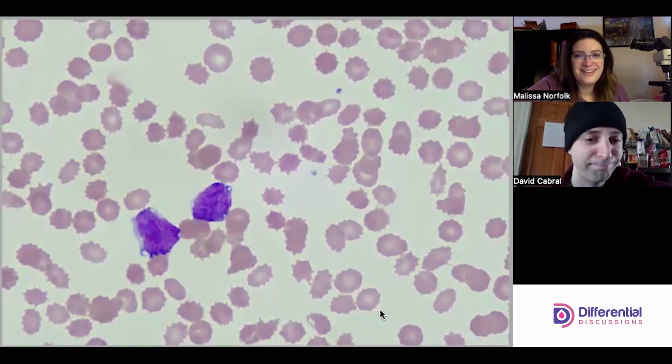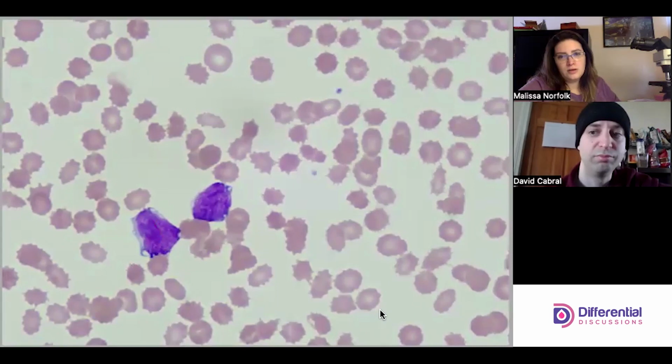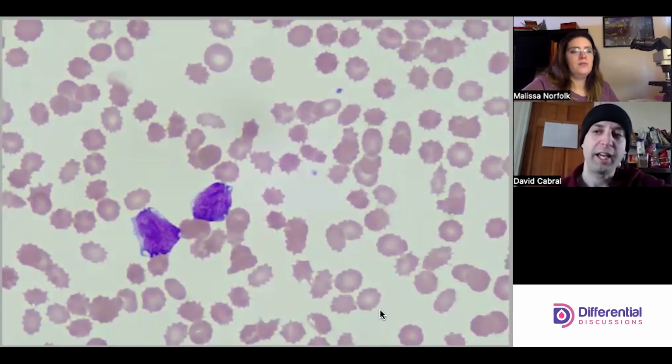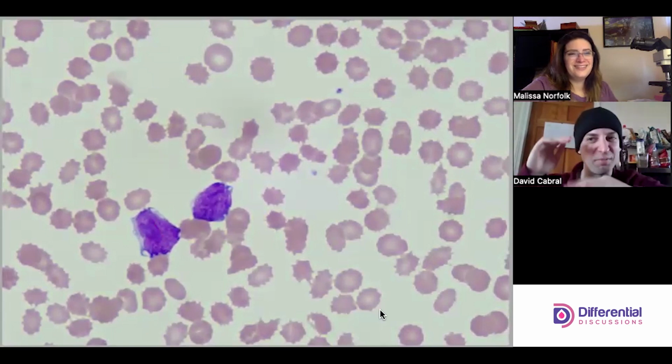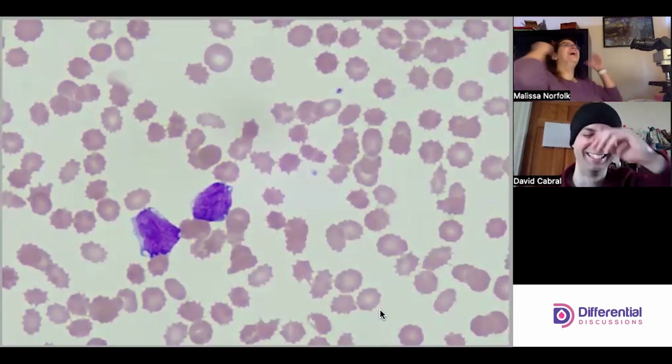I think if people play with the fine tune, I'll try playing with it, you should be able to tell that it's not folding and that it is heterochromatic. I don't know how well people will be able to tell on here, but that's the way that you're going to know if it's a fold or not. It's tough, but these are three-dimensional objects, and there's some differential in elevation, where you can tell that something's maybe higher or lower set. Now we're getting into geography.